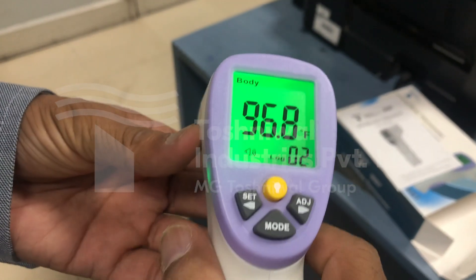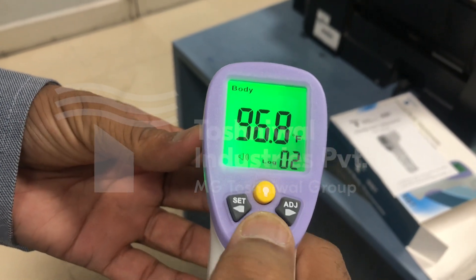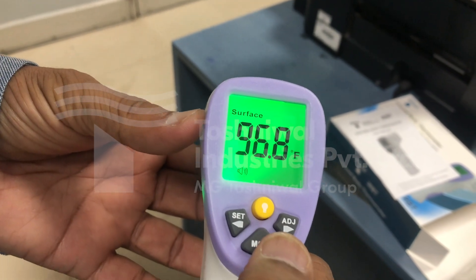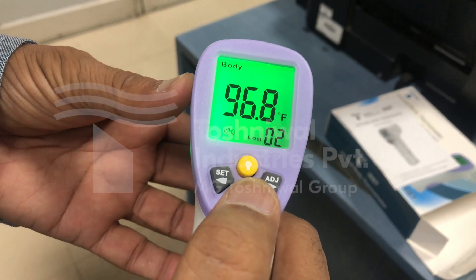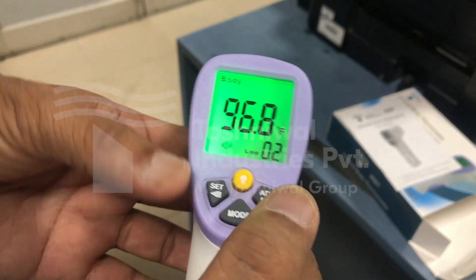The model has two modes: surface mode and body mode. For measurement of the human body, we'll use the body mode.